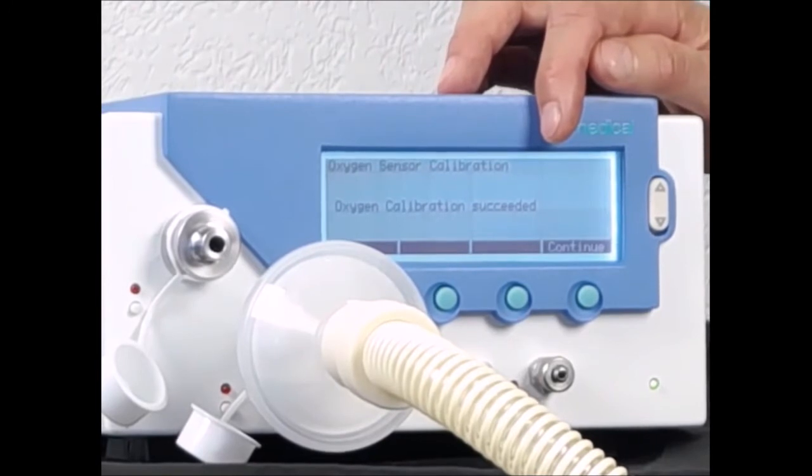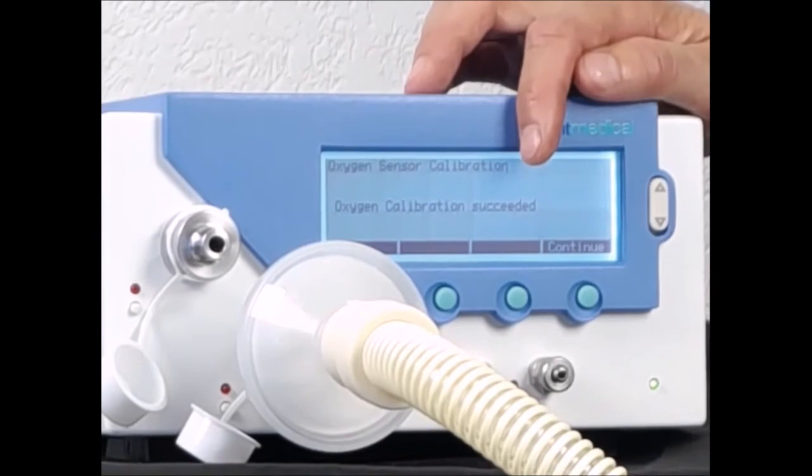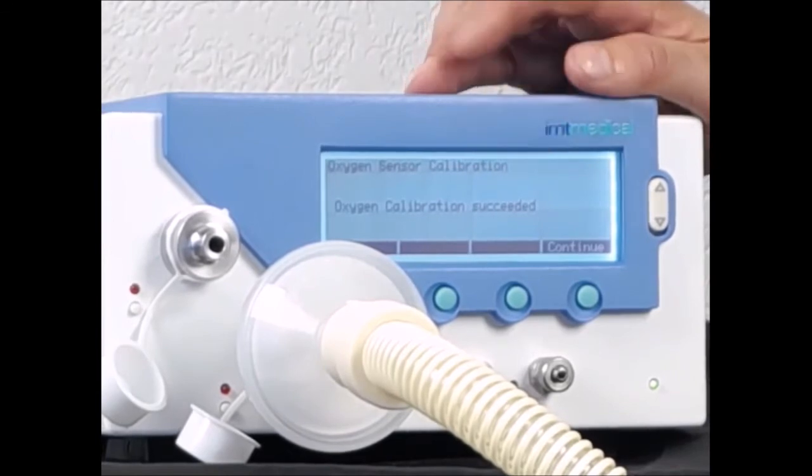I would like to stress the point that the oxygen sensor must be calibrated with a flow. The 25 liters per minute is really important to provide the oxygen sensor inside the PF300 with the necessary flow. It is not enough to have just a little bit of flow — it really needs 25 liters per minute.